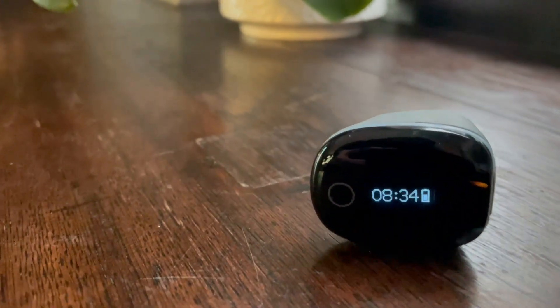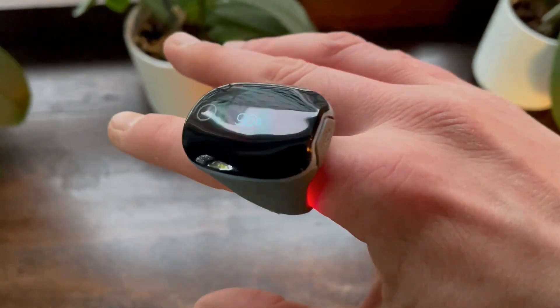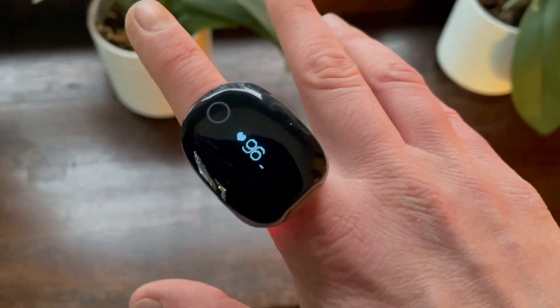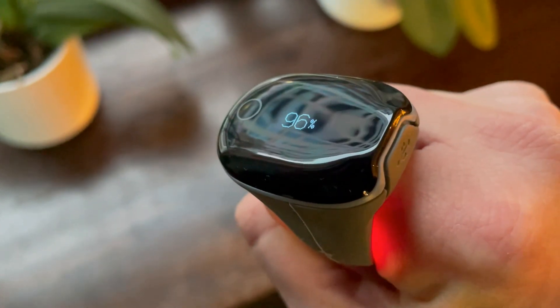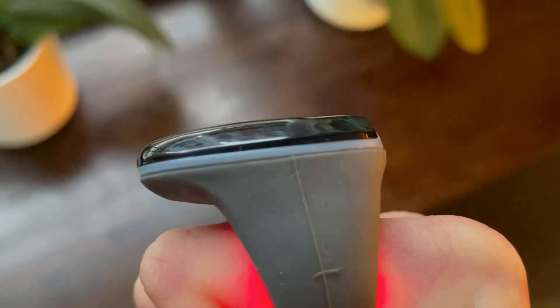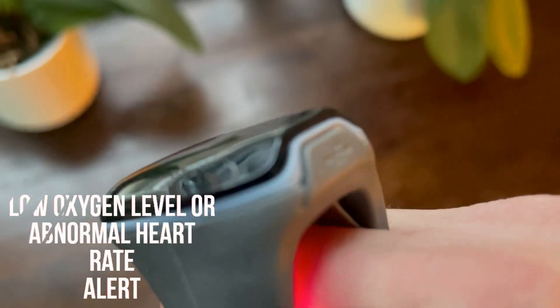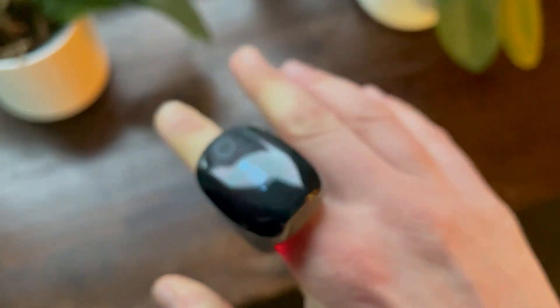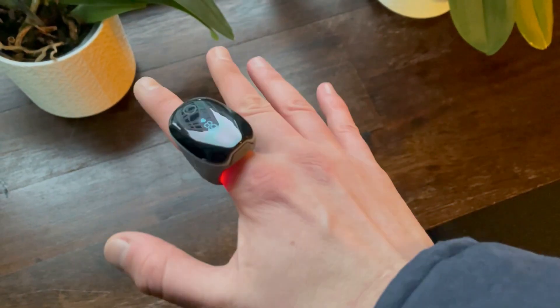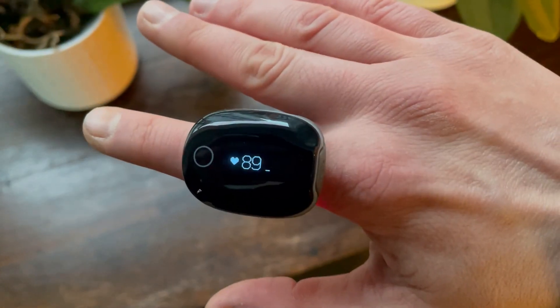The O2 Ring is a medical-grade continuous ring oxygen monitor. As the name suggests, you place it on your finger. It shows continuous pulse rate and SpO2 metrics on the OLED touchscreen, and alerts you by adjustable vibrations if it records a low oxygen level or abnormal heart rate. There's also a free iOS and Android app that records and plots your results onto SpO2 and heart rate charts, where you can analyze trends and export the data.